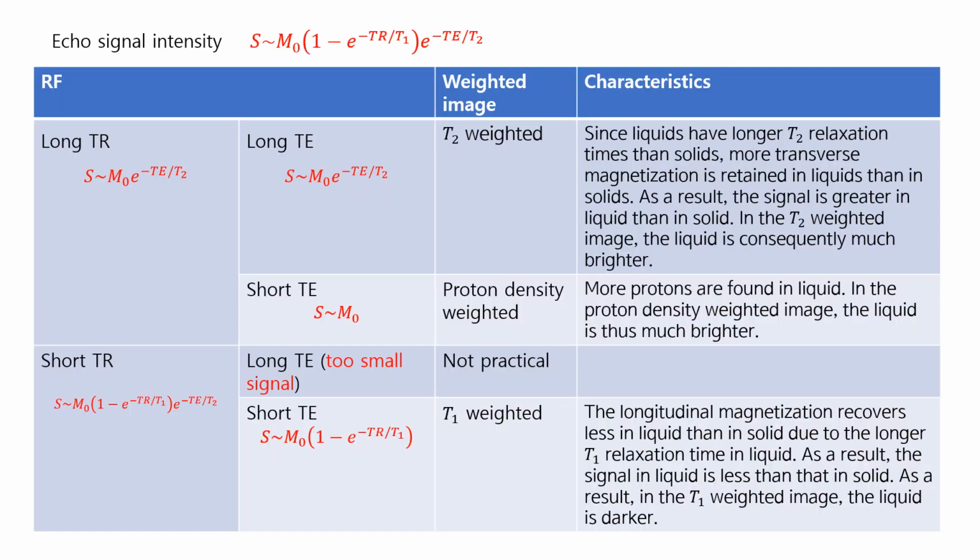This table summarizes what we discussed so far. Echo signal intensity is given by this form. Okay.